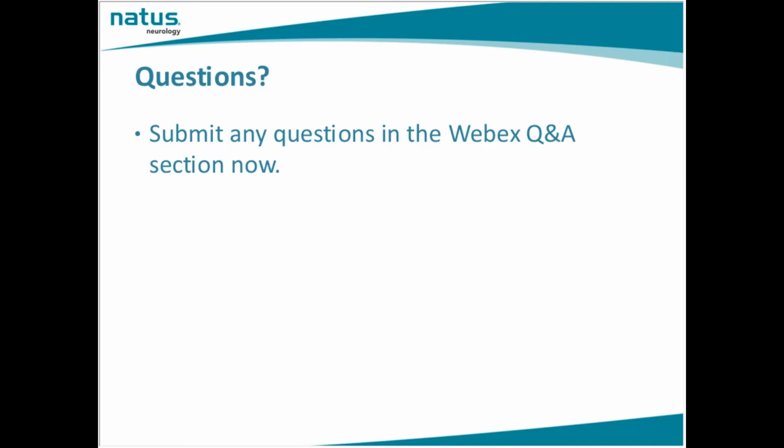So that's the term you're going to use in your exam, in your report, because TCD cannot differentiate between vasospasm and stenosis. It's only by the clinical presentation of the patient. Does that answer your question? I think it does, Ann.